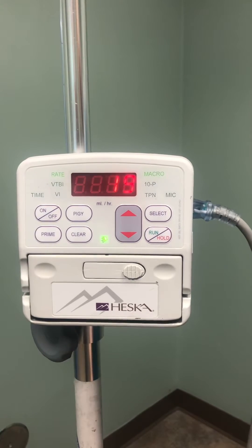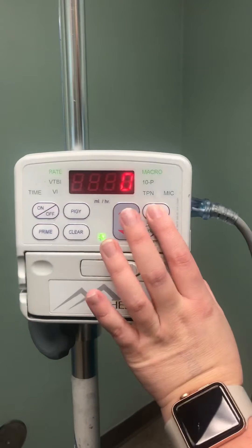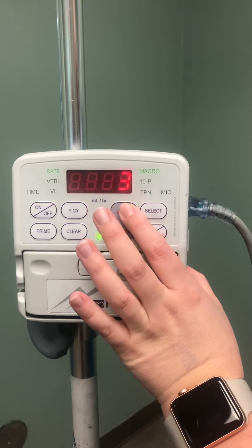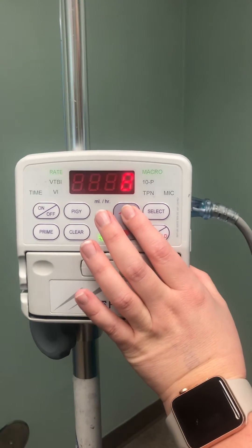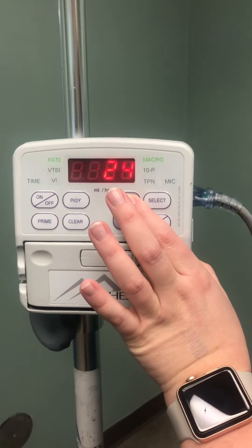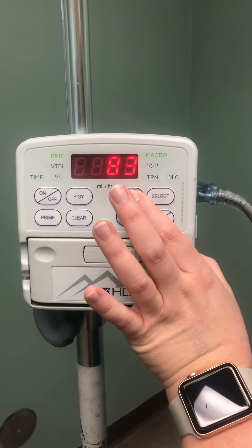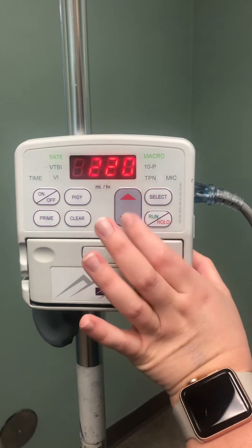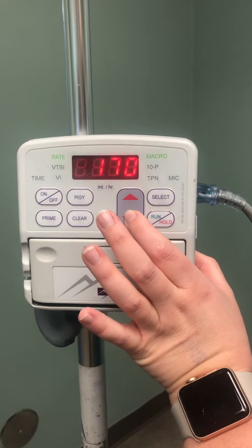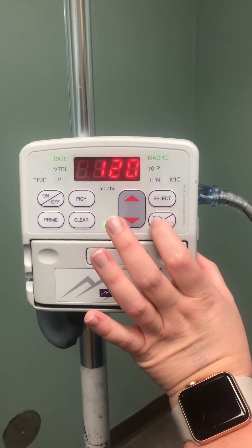Currently our rate is at 19, so we want to clear that rate. Let's say we want it to be 120. You can just hold this button down and it will go up to the desired rate — it goes by increments of 10. Then you can hit select.